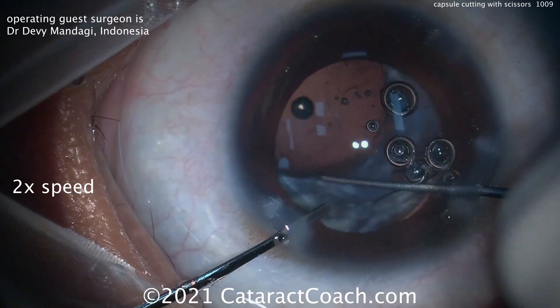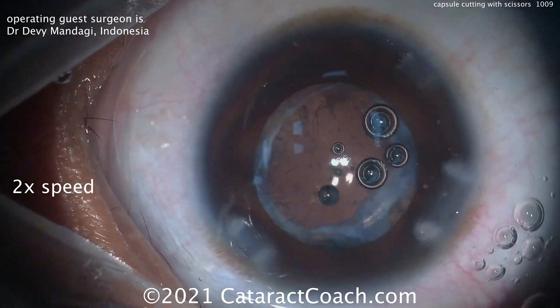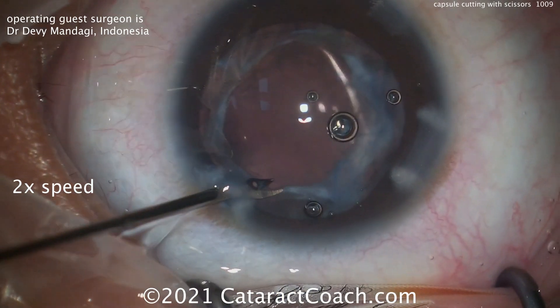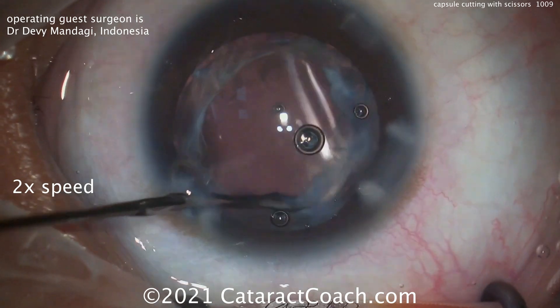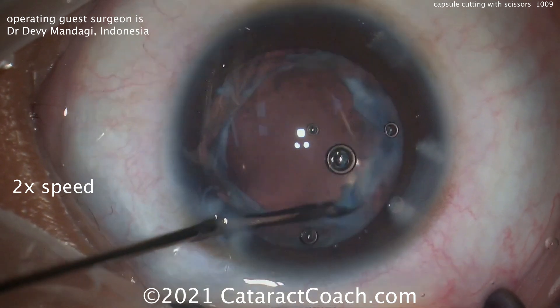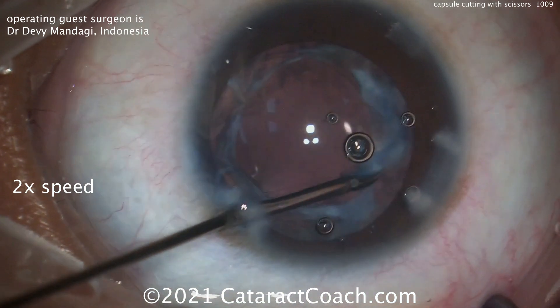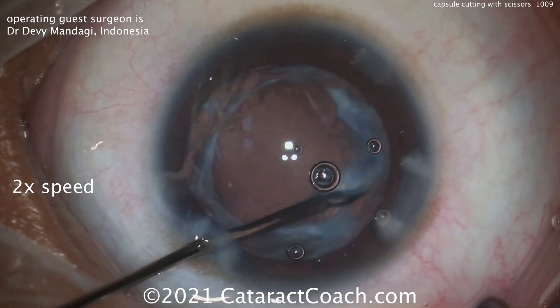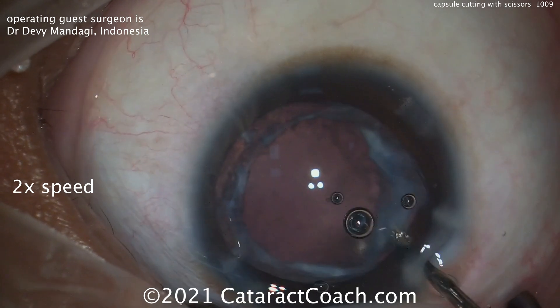You can see that fibrotic capsule still, and he's going to do just a little bit more trimming in that one sub-incisional area. This is the mark of a perfectionist — want to make the surgery as beautiful as possible. Every surgery you do, you're leaving your signature. You want it to look as good as possible and to give the patient the best functional visual results. Take pride in your work — that's very important.